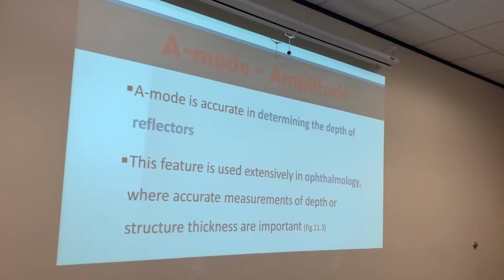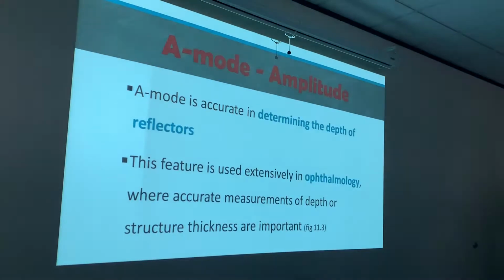You can see on the bottom of that graph, those echoes are being represented, but where it's black, where the pupil will be, nothing is being represented, meaning it's not getting any reflections back, which is why our bar is flat down in that area. We're not getting any amplitudes right there. But as it travels distally, or deeper into the body, you see that it's picking up more and more reflections or echoes. Most important, I want you to know that A mode is associated with ophthalmology, even though they don't really use that anymore.